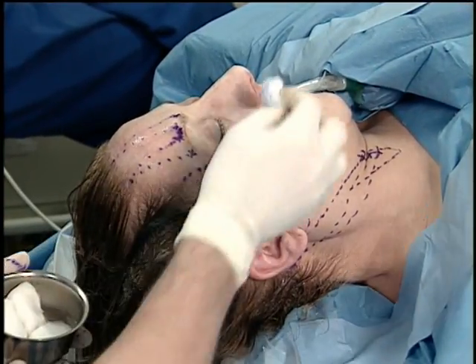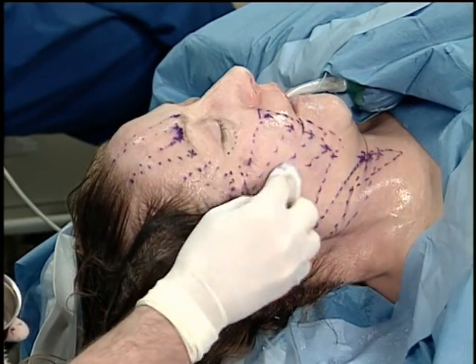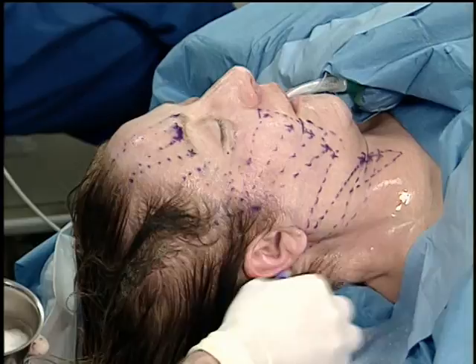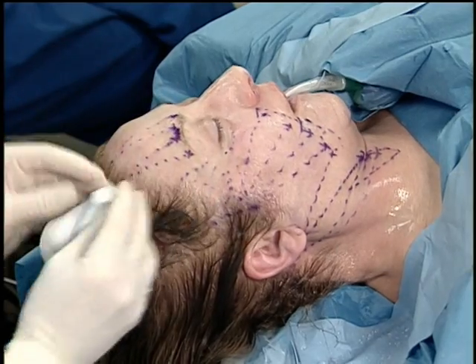We use a lot of chlorhexidine type prep on the face. And we'll dab it off, and we use a non-water soluble marker to ensure that we don't lose our marks. Be careful of the eye, of course. And once we have that prepped and draped, we can dab that off, and we will be ready to go.